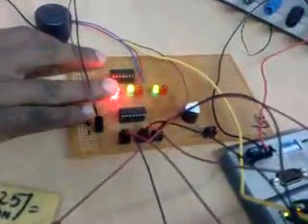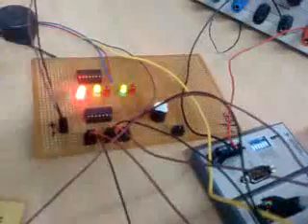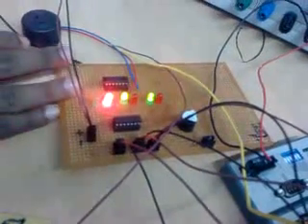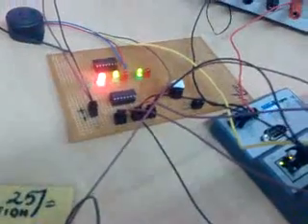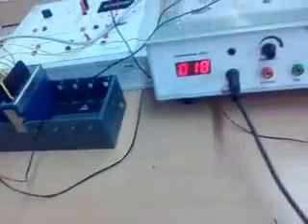Here in the output circuit, whenever you have an abnormal activity in any of the three parameters, the buzzer will sound, which will indicate to the people that you have an abnormal activity. Finally, we have also given a provision for connecting a vibrator. Right now, the vibrator is not available with us.